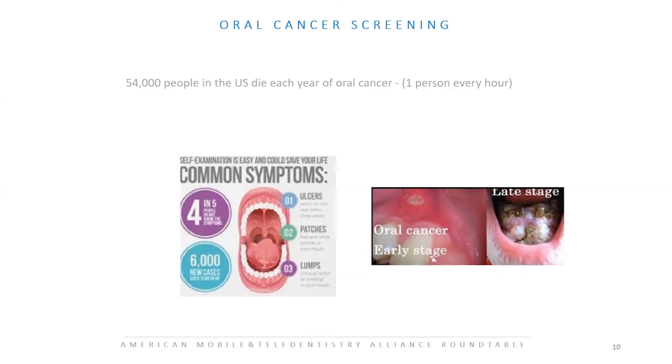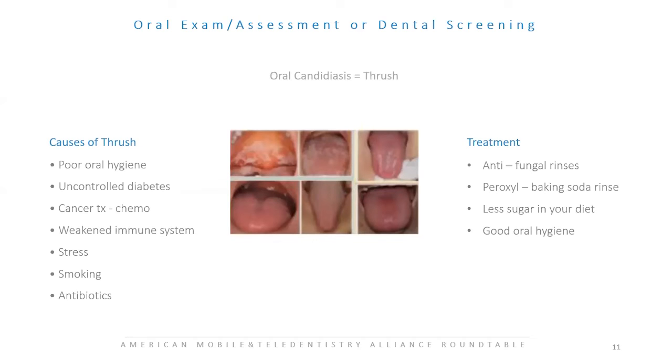Not only for the oral cancer screening, but it's just an oral assessment and exam.